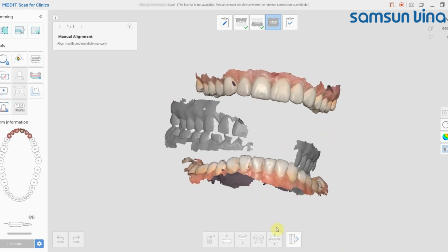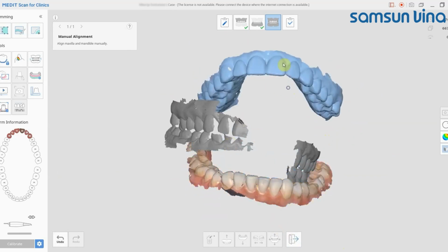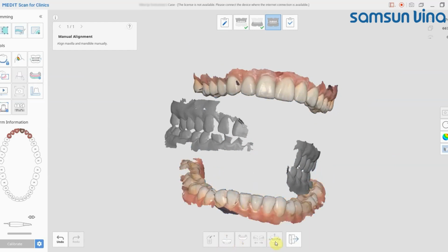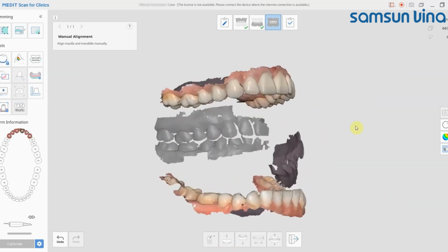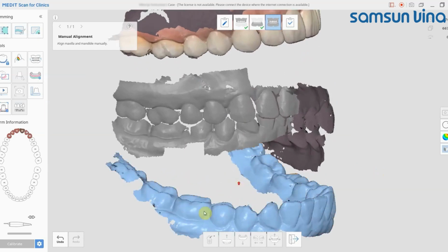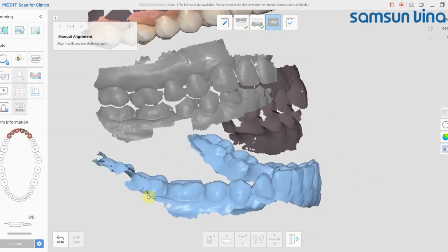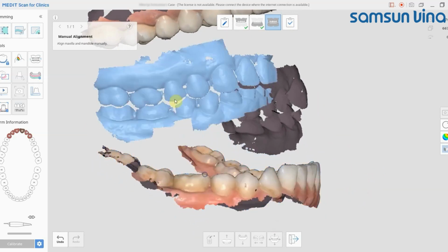Okay, and then if the components are manipulatable like this, that's fine, you're in the right position. If not, you can click this icon down the bottom, detach all, and it will separate all of the components of the scan. So once we've got them all apart, all we need to do is click on corresponding points on both the lower and the bite scan and the upper and the bite scan. Okay, so you can do up to 3 points on each scan. So you can just do 1 if you want, but the more you do, the more accurate it will be.